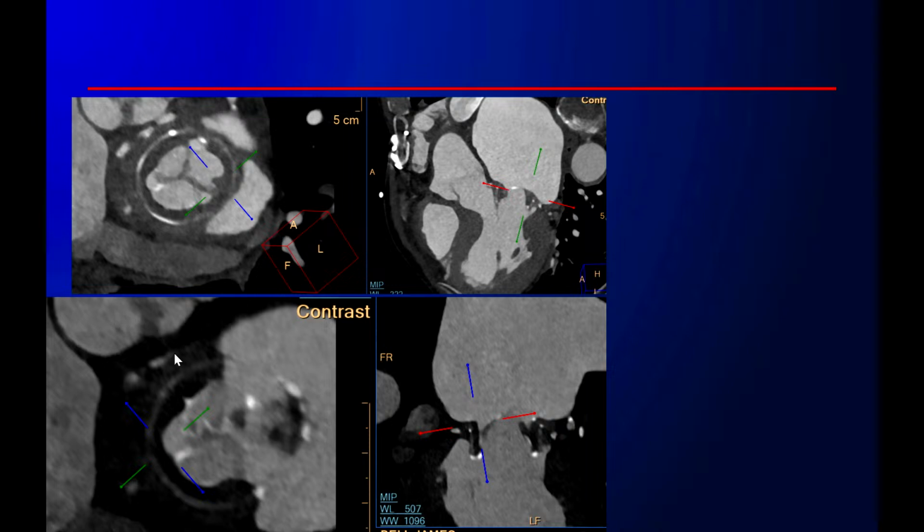You can say that, obviously, this area here is subvalvular, on the ventricular side. But if you look here, there's some tissue also on the atrial side. And I did some literature search; most of the literature vaguely mentions it is most common on the ventricular side, though some literature says the atrial side.